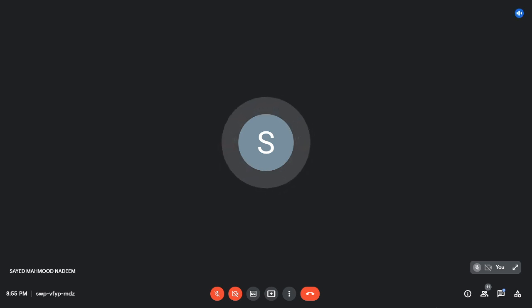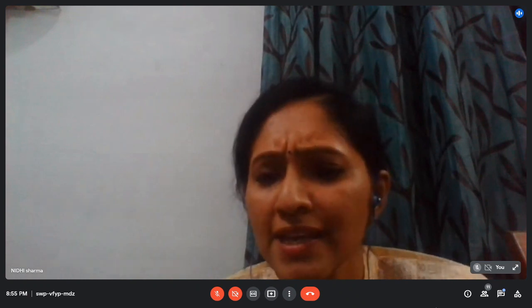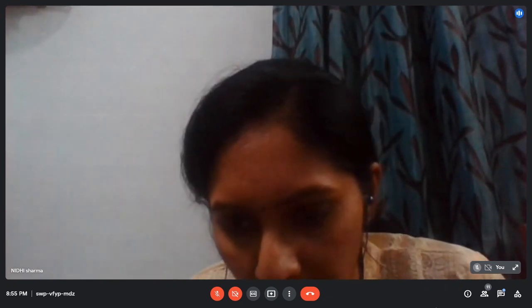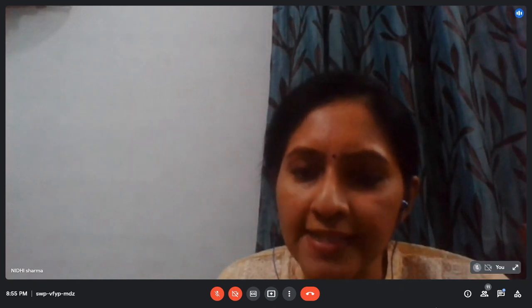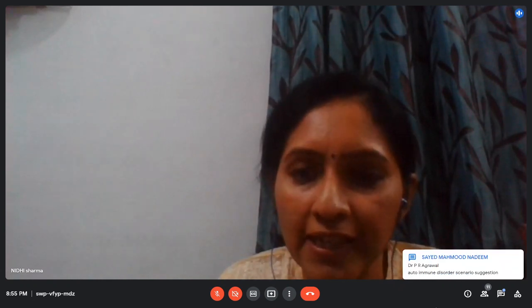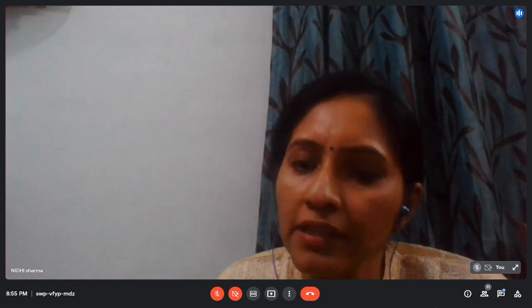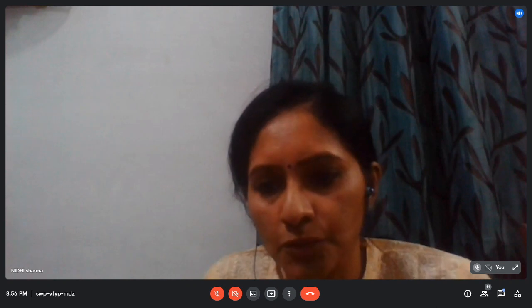Dr. Nabanita, after your answer to her question, says, so signing out with the machine value is okay with the clinicians in that ET case? No, you're talking about that case where the count is between 8 to 10 lakhs and you're not sure whether it is 8 or 10 lakhs. In all such cases, I always like to put a note or a disclaimer that the machine has an upper limit that you can really get back and check. Once that is crossed, you can put that note that this is the marked upper limit and it is beyond that, and therefore this is a case of thrombocytosis. That would actually be all that you need to do.